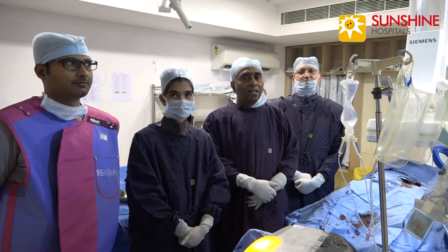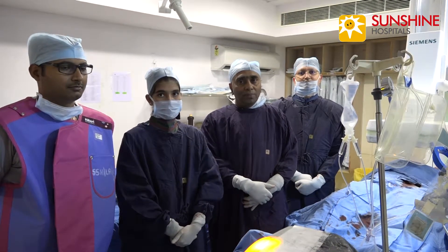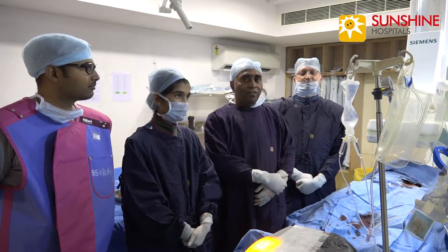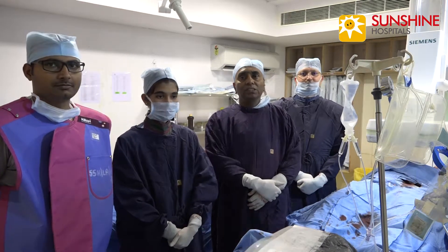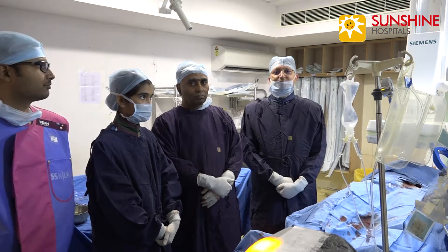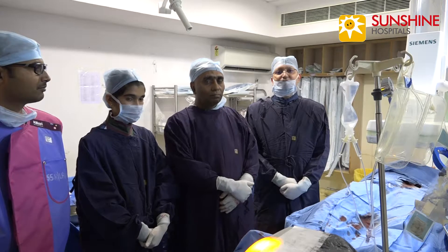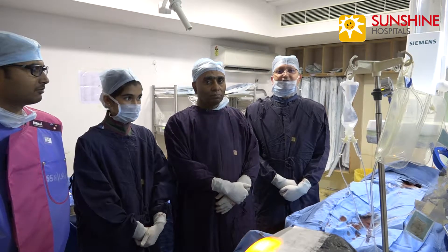Now we have completed the insertion of the Select Platinum IVC filter, along with my friend Dr. Sanjay Kumar, Sister Shamala, and our technician Mr. Krishnamohan. The IVC filter is a very simple, easy, and safe method to deploy through the femoral vein and prevent further pulmonary embolism.